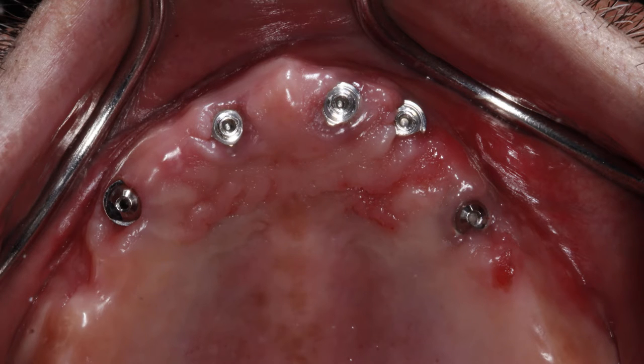What we're looking for is the shoulder of the multi-unit abutments to be at the tissue surface. In this case, the tissue has overgrown slightly, and you can actually work around that with your final restoration. So you don't necessarily have to replace your multi-unit abutments as long as you have access to them.